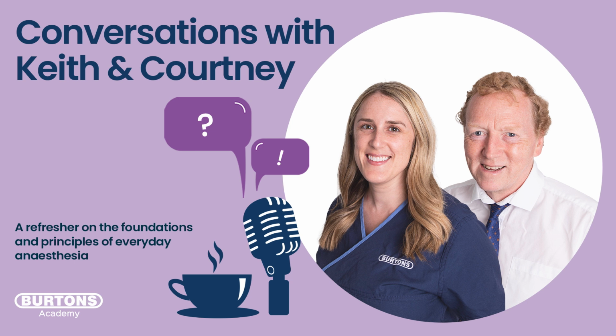Yeah, I just think there's one thing before we go too far, let's just think about what a pulse ox does, because I think people might be surprised. So a pulse ox is very good at determining oxygenation, actually percentage of oxygenation, but has very little information on the amount of oxygen being carried in the blood. I think those two are very different. Maybe we can just clarify that before you carry on with what you were saying.